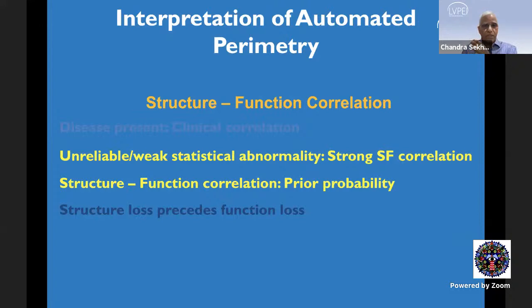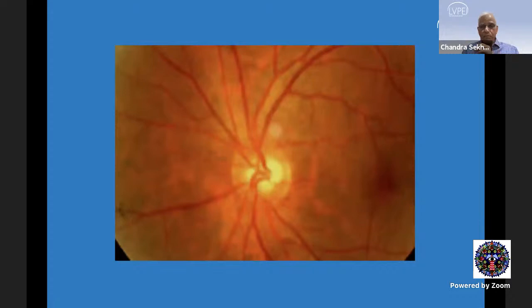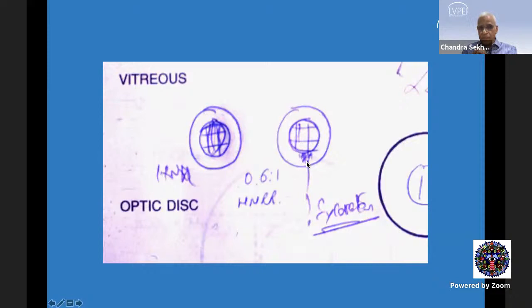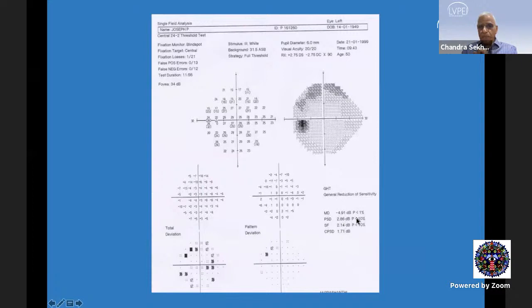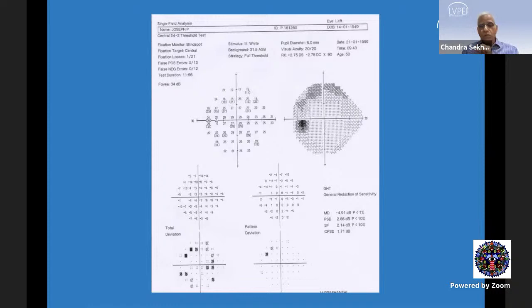Moving on to reinforce the concept: an unreliable or weak statistical abnormality with a strong structure-function correlation — if you have strong structure-function correlation, your prior probability of disease is higher, and even a weak statistical abnormality can indicate disease. Here is an example of an inferior excavation where the optometrist felt the disc was healthy. GHT is borderline, PSD is flagged only at 10%, but there is a cluster of three points in the superior arcuate area that are statistically abnormal — satisfying only one of Anderson's criteria. Because it correlates with the clinical abnormality, I would call this early glaucoma.